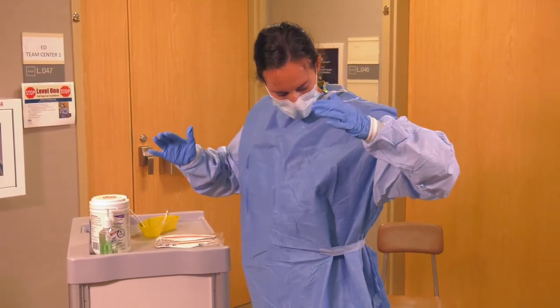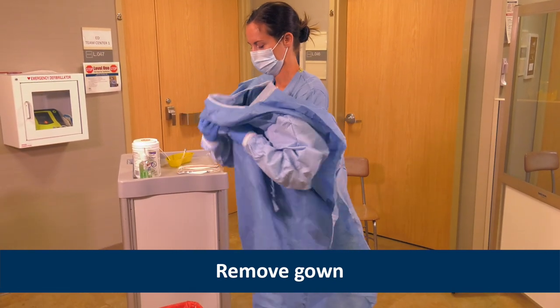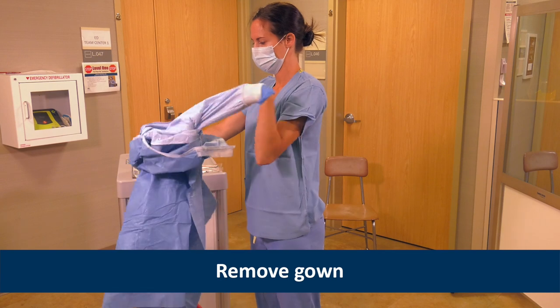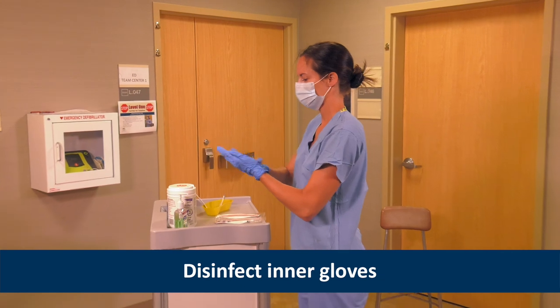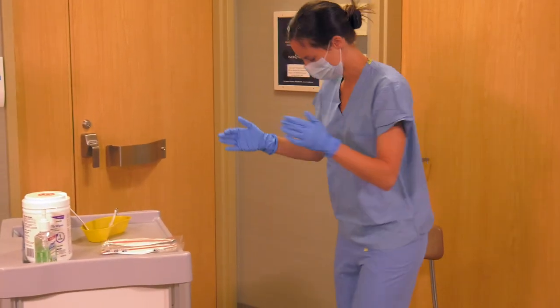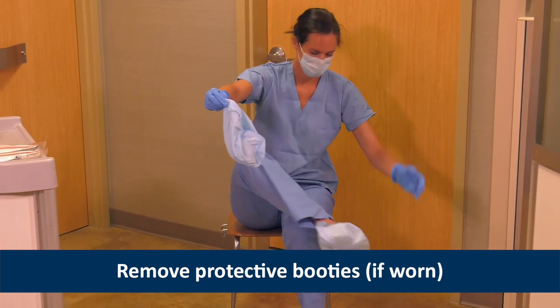Heather removes the gown by untying or gently breaking the fasteners. She carefully pulls the gown away from her body, folds it inside out, and places it in the waste receptacle. Heather disinfects the inner gloves and removes booties if worn. She sits on a clean surface to avoid contaminating her pant legs.